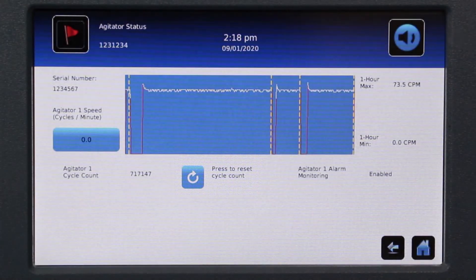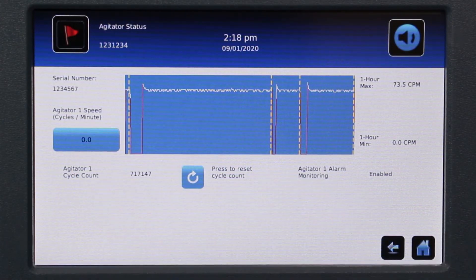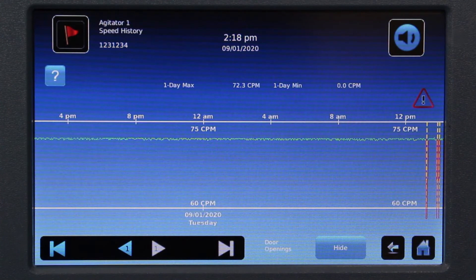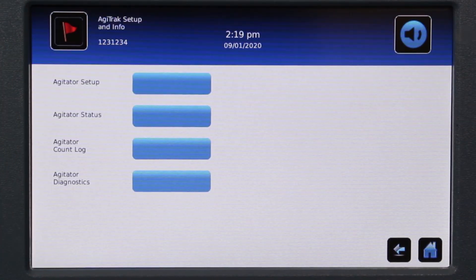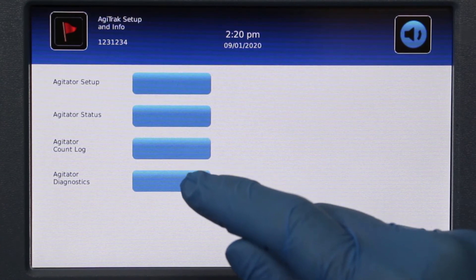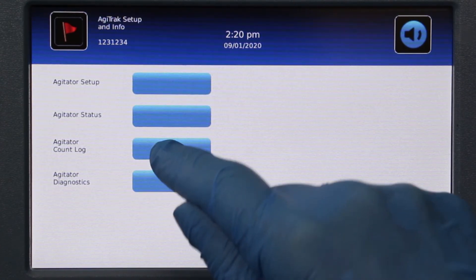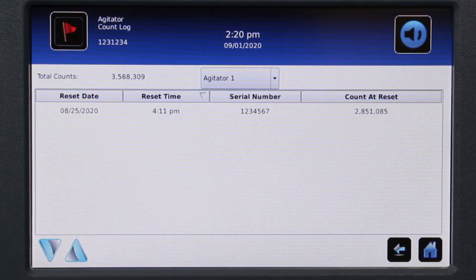Touching the button that shows the current agitator speed will bring up the agitator speed history graph. The Agitator Count Log displays the cycle count history for the installed agitator.